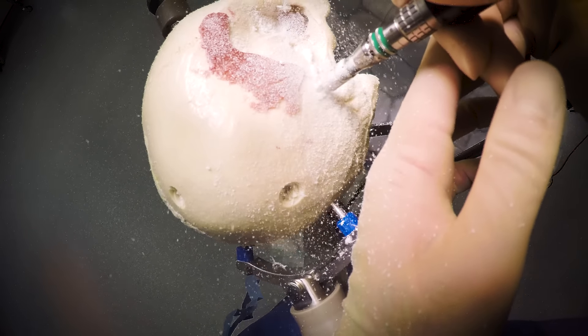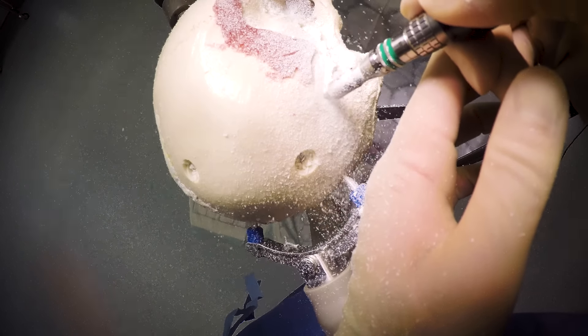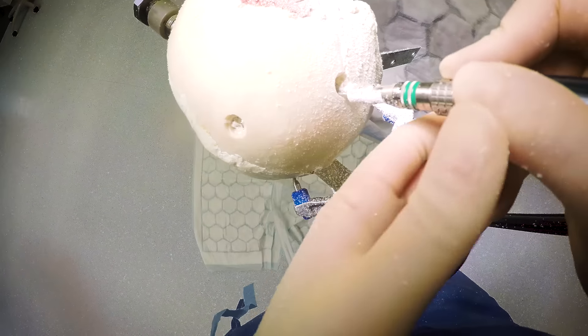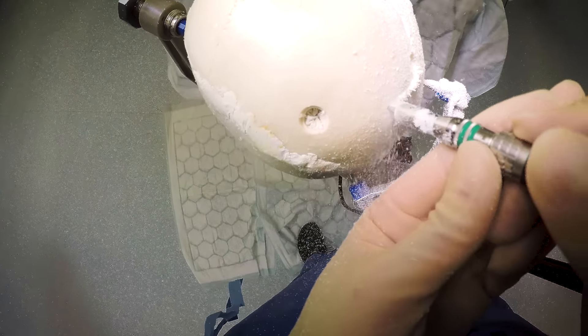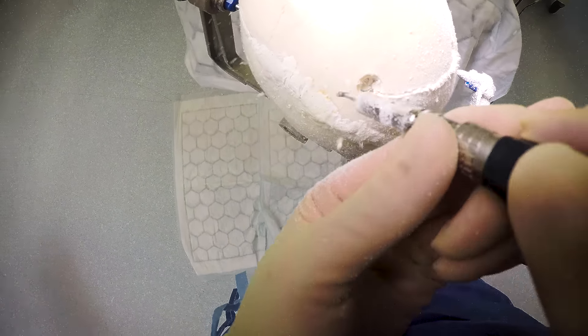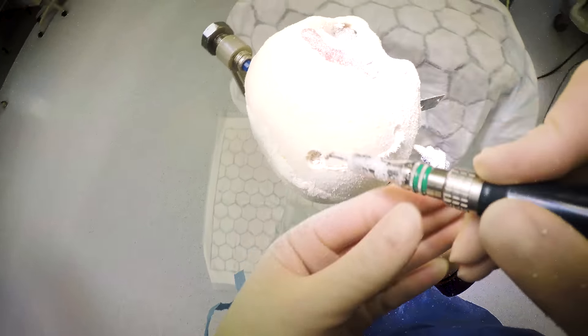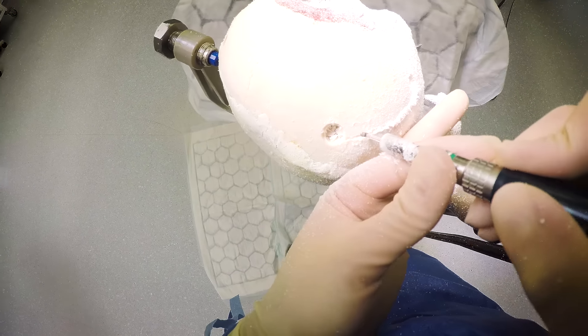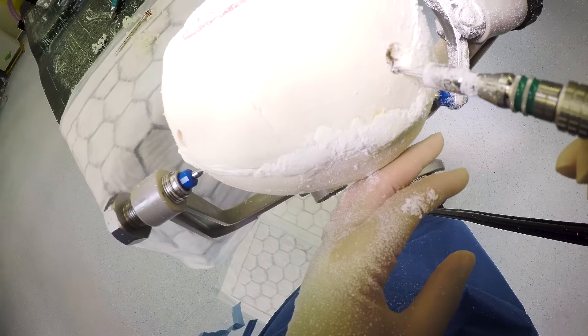Here you can see we're going to connect the burr holes. We're leaning back ever so slightly so that we're cutting up and away from the dura. Control the foot plate as it comes out of the burr hole — the next burr hole shows you what happens when you don't. If you don't control things, the craniotome can suddenly come out and catch things in the blade, like your finger, or your attending or consultant's finger.